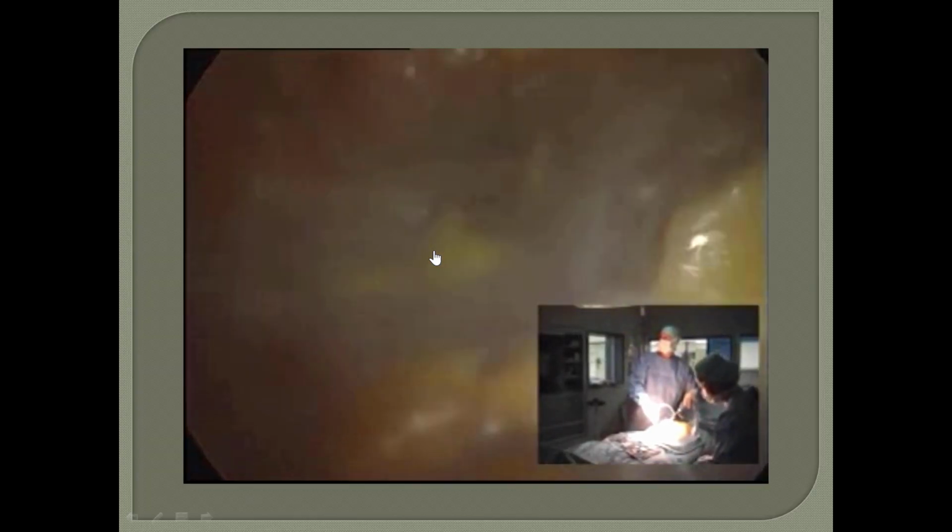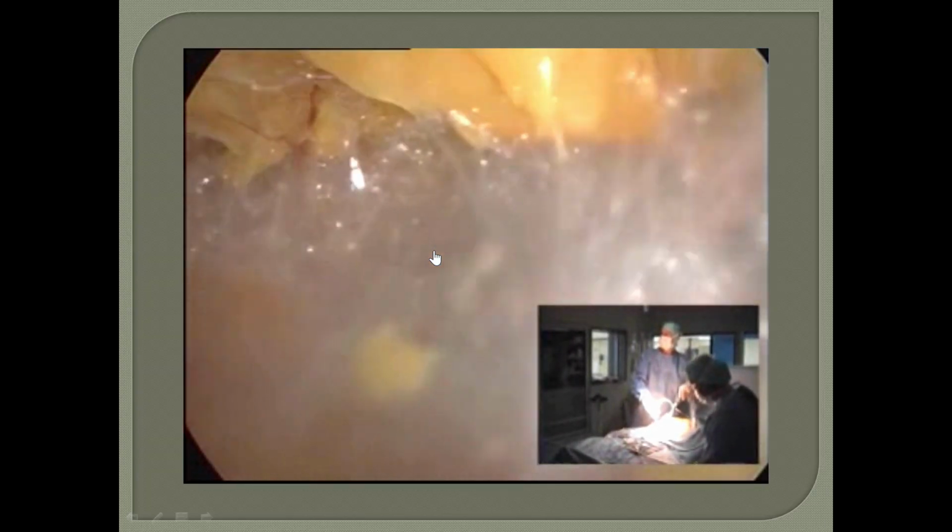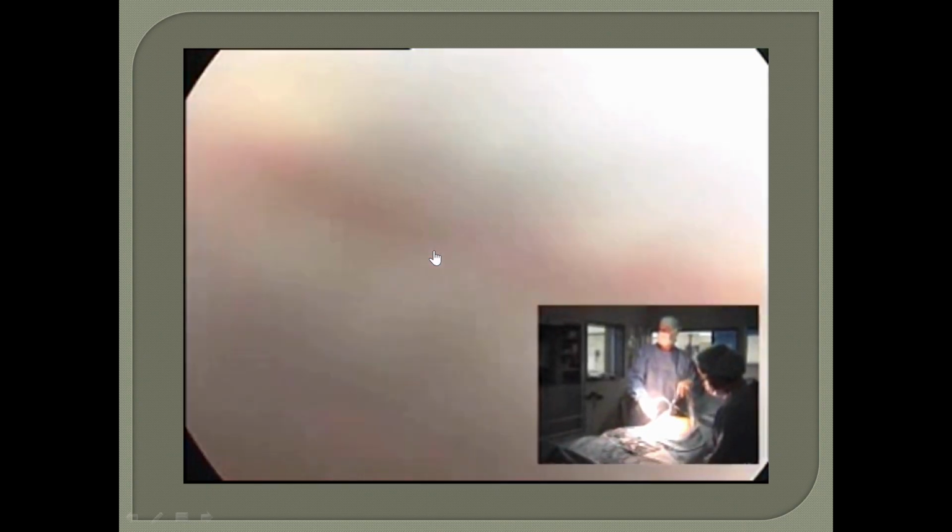You just stay in this layer, and you just open and create it. You can see laterally my movement. It's just a movement to create, and you just stay in this typical aspect.